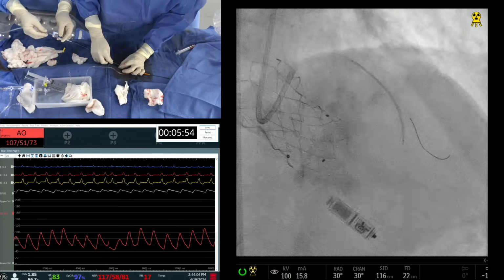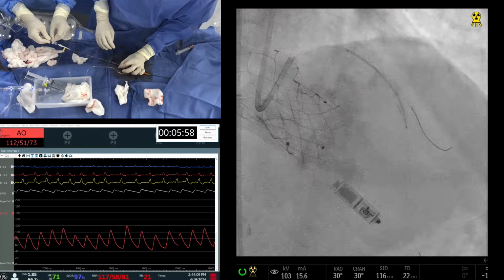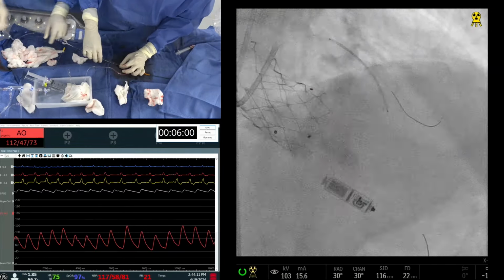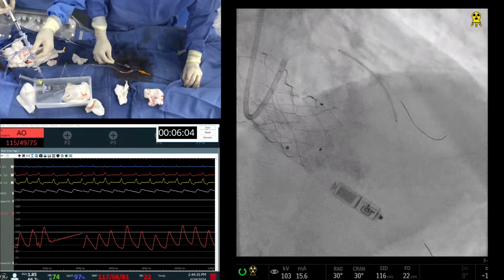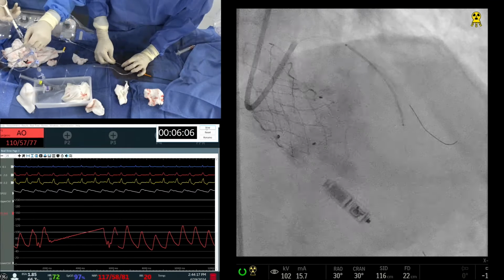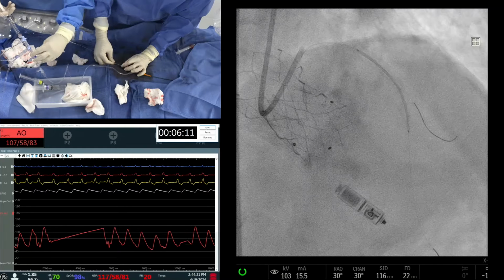Because your stent is 3.0 and proximally the area is not that apposed, even if you deploy it and then pull the wire, your guide gets sucked in, your wire gets trapped, you deform the stent, and you run into a problem. I think you're all good now. See that? Okay, take a picture, okay?